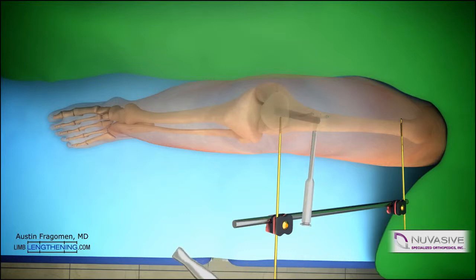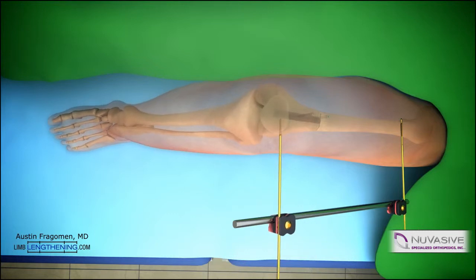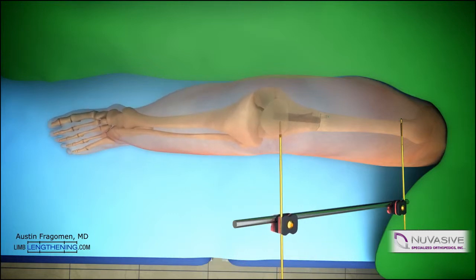The corticotomy, or osteotomy, is then completed in a standard fashion with an osteotome. The deformity of varus can then be corrected and locked into place with the external fixator, which gives great stability during reaming.